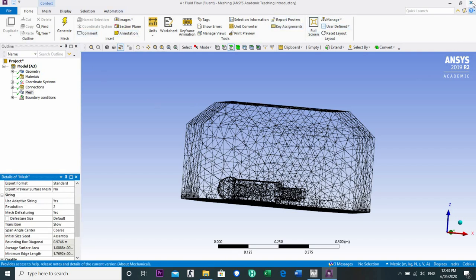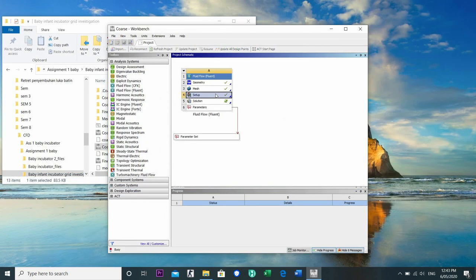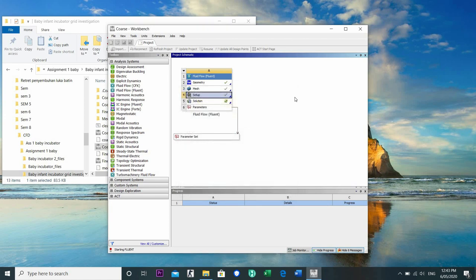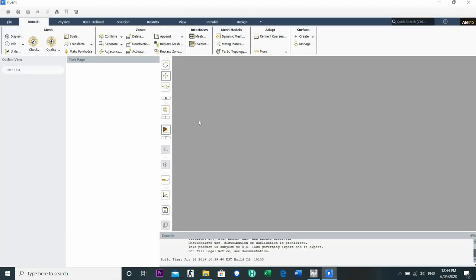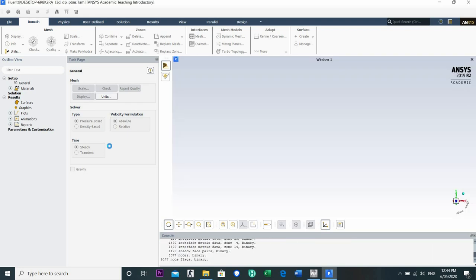then go to the mesh, and then adaptive sizing, coarse, and then generate mesh again. And then after it's done, you can close this part, and then you can go to the setup, double left click, and it's okay, double precision at that box. Okay, as we can see here, we're going to use time steady because it's a big one, and it's not going to be transient because it would take a long time to proceed the simulation.